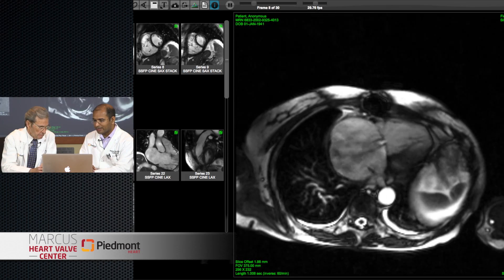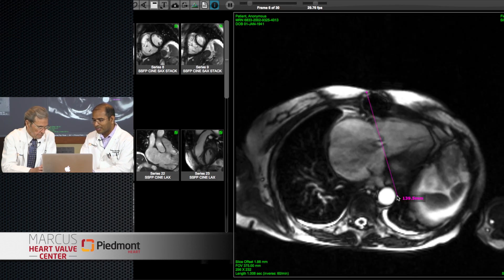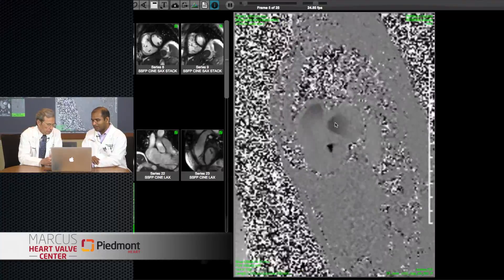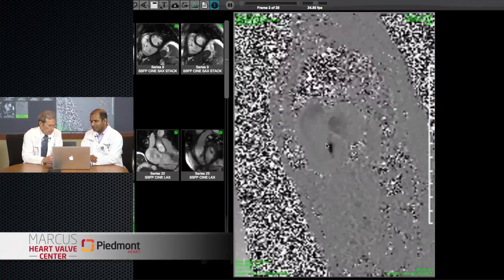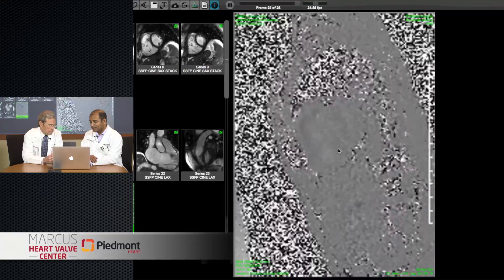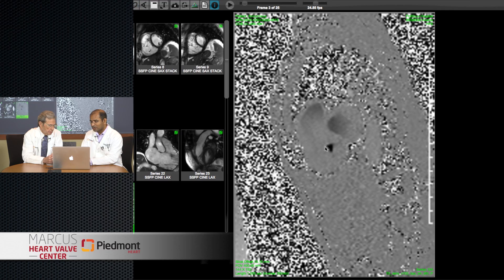Since we have these images, we can go perpendicular to the flow and actually measure the tricuspid valve insufficiency. These are called phase contrast images. This black area you're seeing is the area of tricuspid valve insufficiency. We can actually measure the effective regurgitant orifice area — the ERO — by drawing out that area. One of the arguments about echo evaluation of TR is the lack of quantification, so with MR you can get the ERO and then calculate regurgitant volumes and regurgitant fractions.